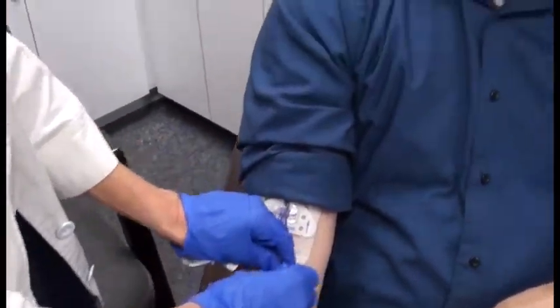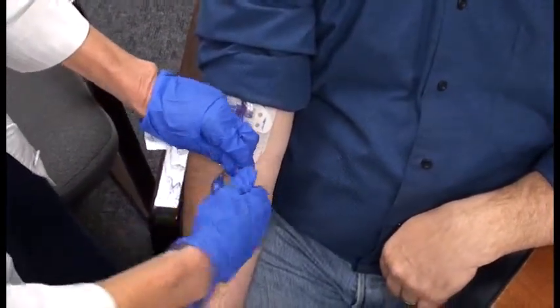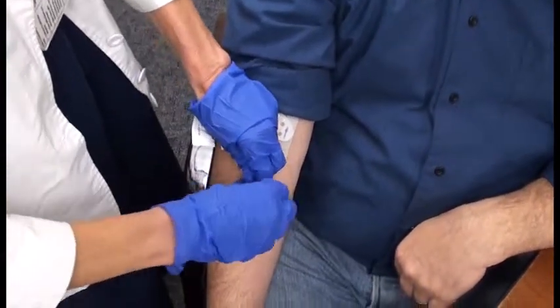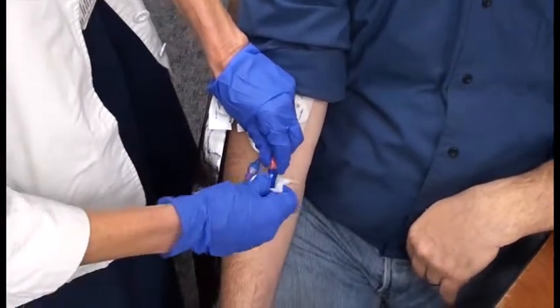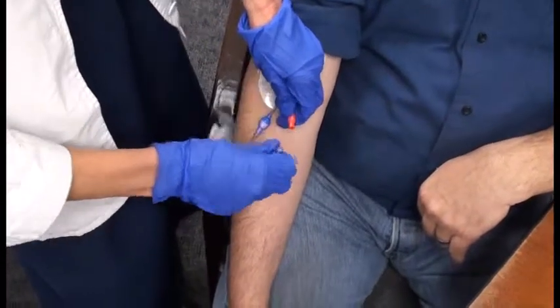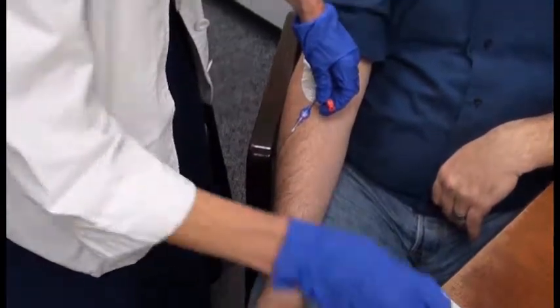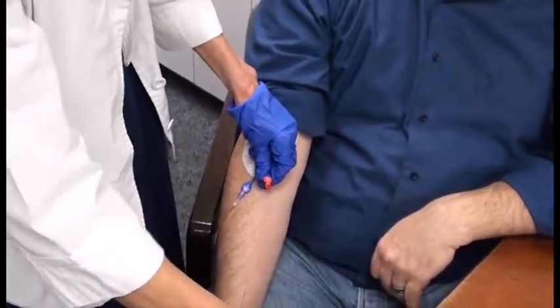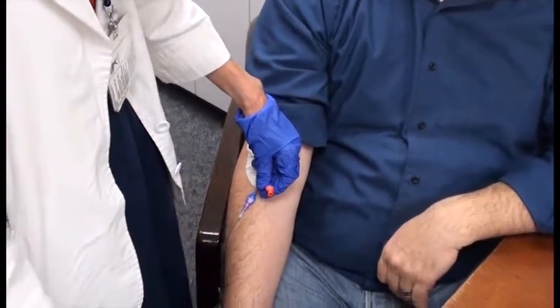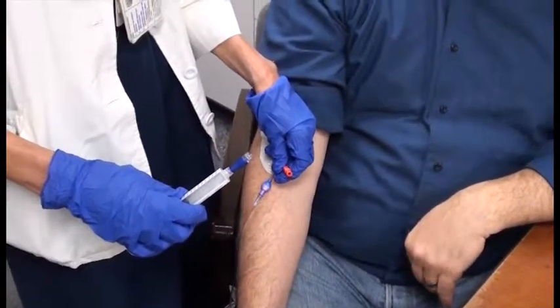Cleaning around the end, letting it dry, and then trying to unhook it. This is what we said before: if it's wet when it goes on, that's a problem. So you want to be careful to make sure it's dry if you clean in between. Otherwise it locks in like cement, and then the next nurse has a hard time getting that off. That was exactly what we wanted to avoid the last time. Make sure this dries completely before you put the new cap on.